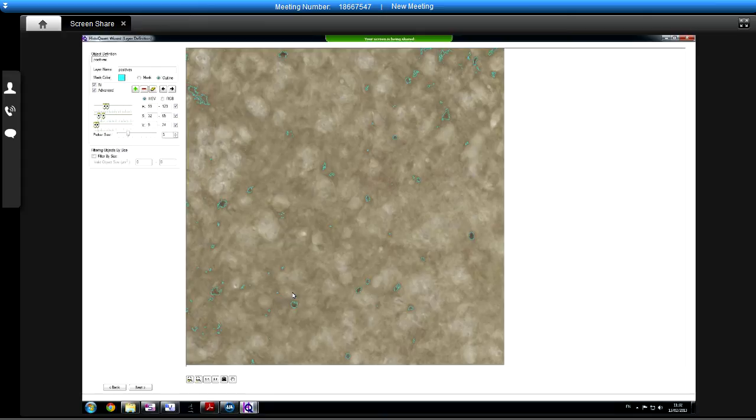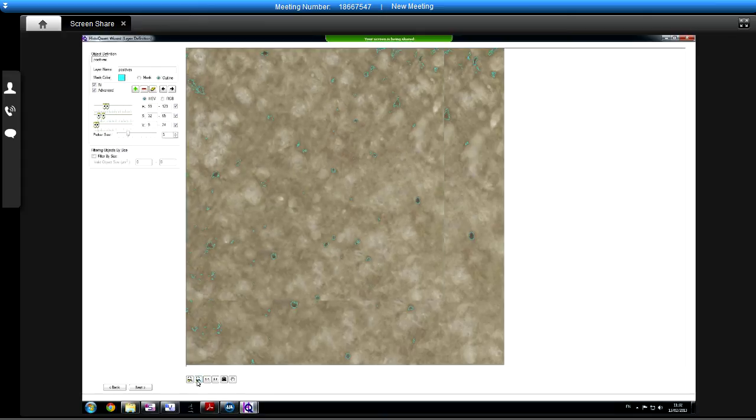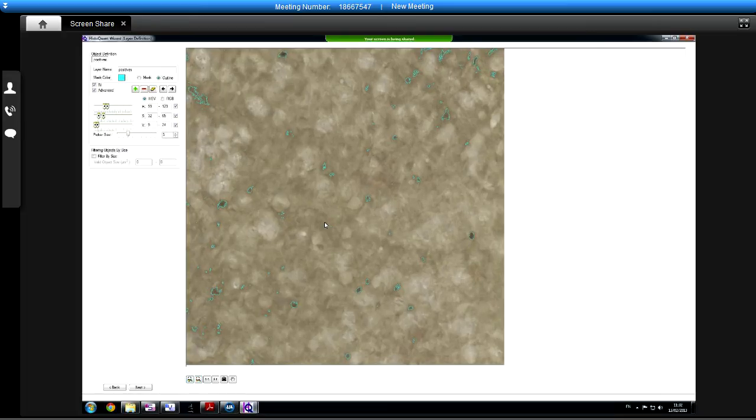So at the moment, as far as I see it, we've got the positives, and we've got false negatives in terms of small things which aren't really, and then we've got some things like this which are also not correct, I would say. So maybe let's just go back a step, because they came in there. So at this stage, what else would you see as positive? This sort of thing? Okay.